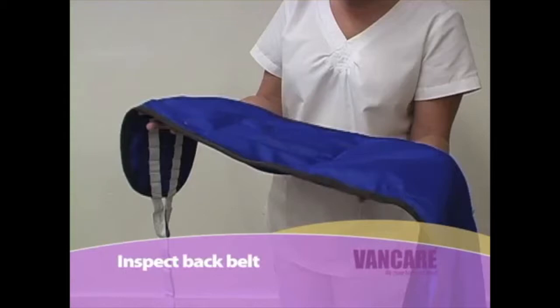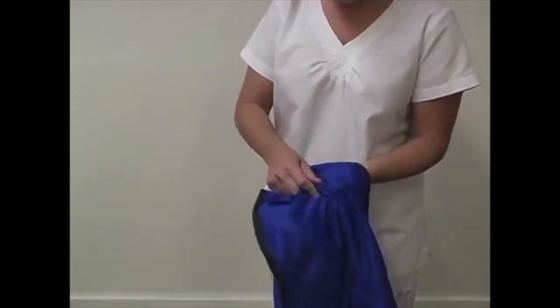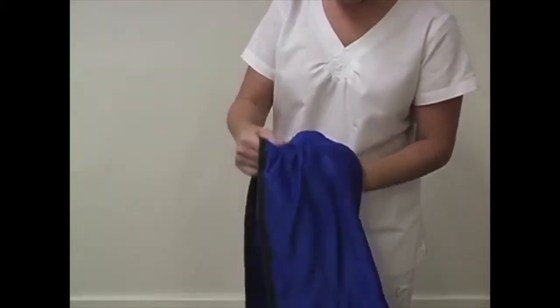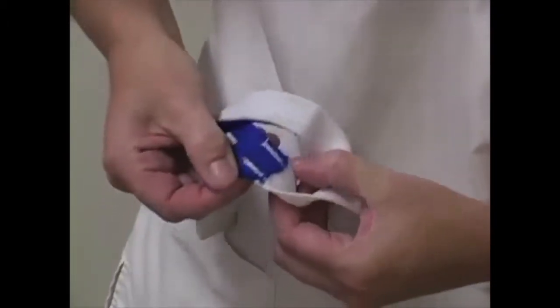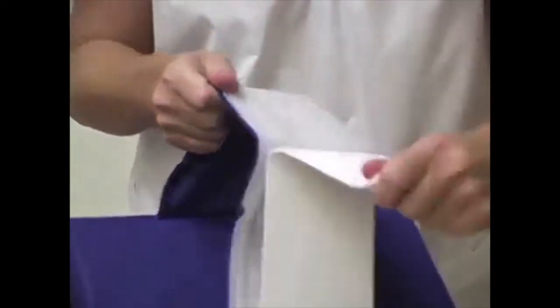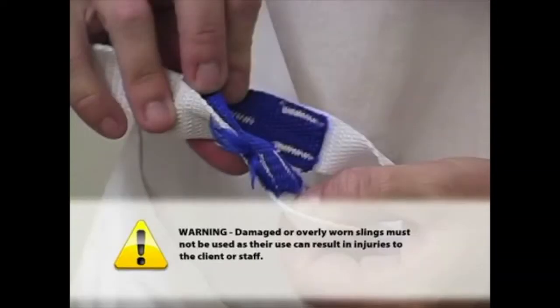Inspect the back belt. Before transferring a client, it is important to check the back belt or sling for signs of damage, for loose and missing stitching, and for tears and excessive wear that might cause it to fail. Be sure to inspect the stitching that attaches the loops to the back belt or sling. The Velcro on the safety belt must be checked to make certain it fastens securely. Damaged or overly worn slings must not be used as their use can result in injuries to the client or staff.